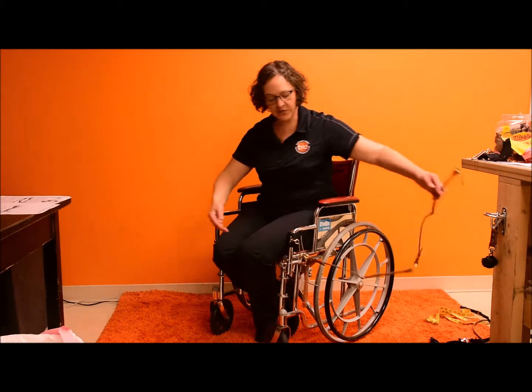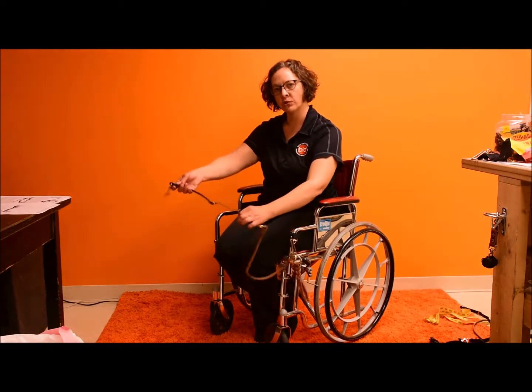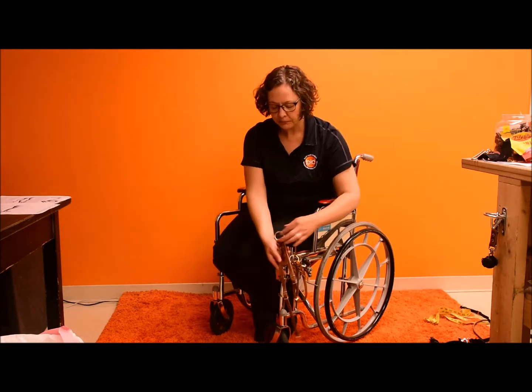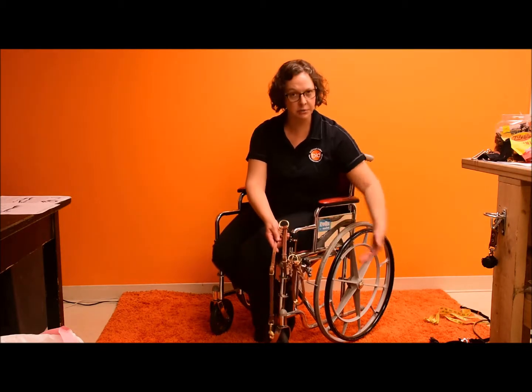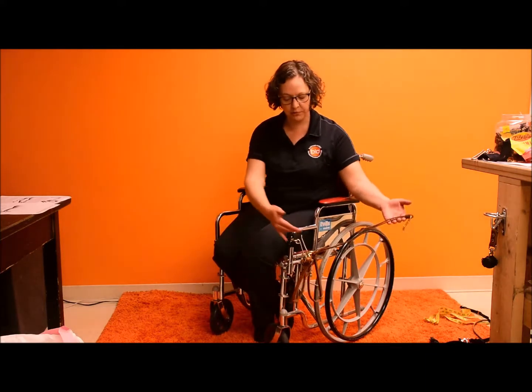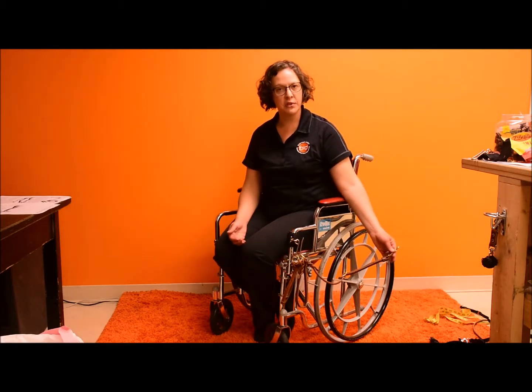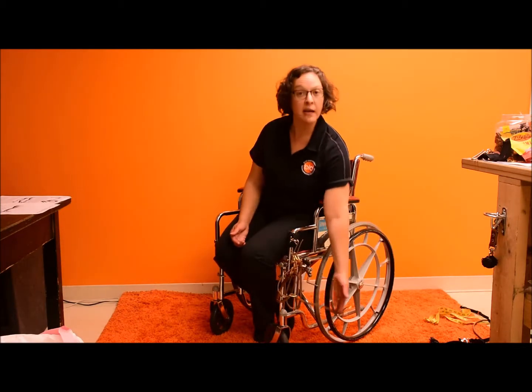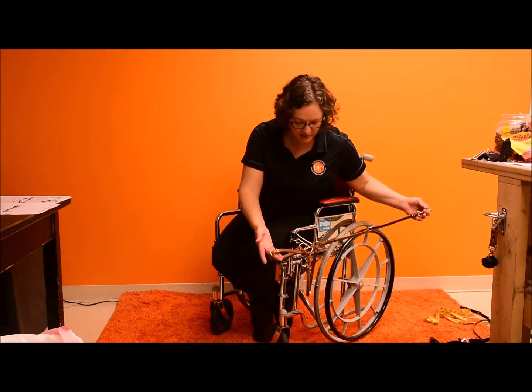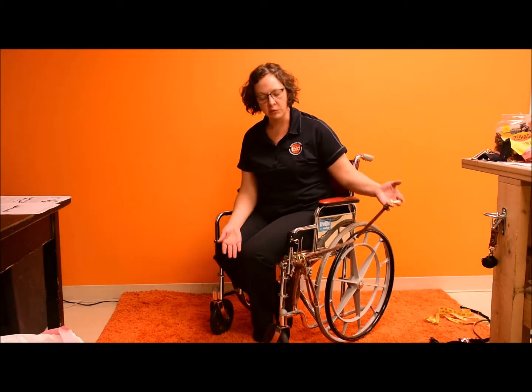Again, each of these sections is adjustable. So you might want to adjust this so it's just long enough for the dog to be able to get behind or in front of the chair to get through a doorway, or other medium length task. And then finally, when you're working the dog next to the chair, to prevent the leash from getting tangled in the wheels, you want to work with the short position. So drop the 3rd ring onto the hook, and now you have the short position, which allows the dog to work closely to the chair, lay down next to the chair comfortably. And you can see that this leash has naturally gathered itself up, so it's not getting tangled in the wheels as we move.